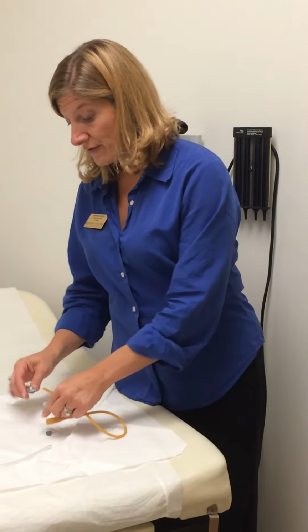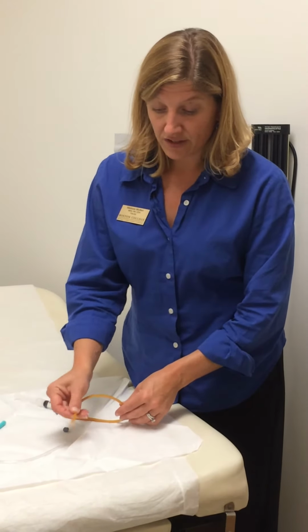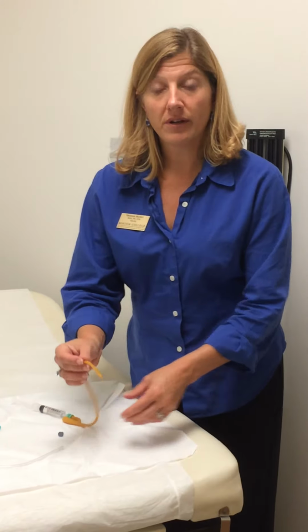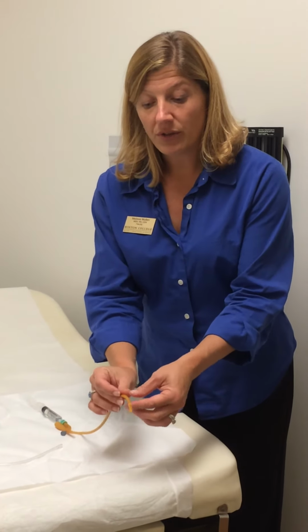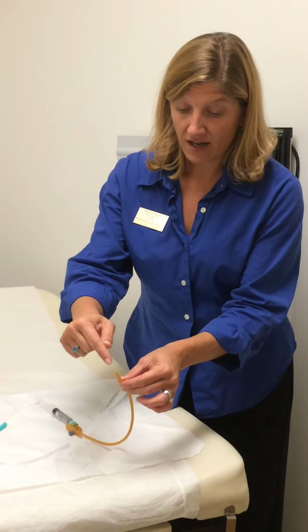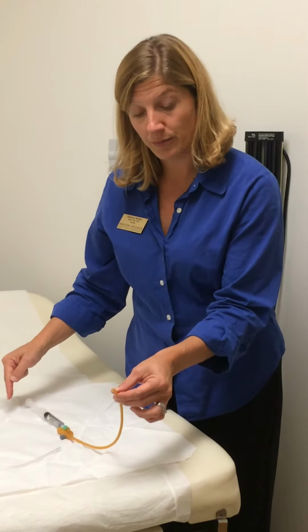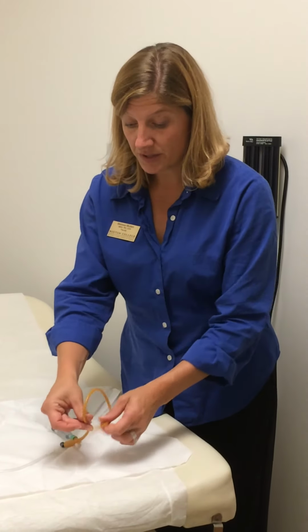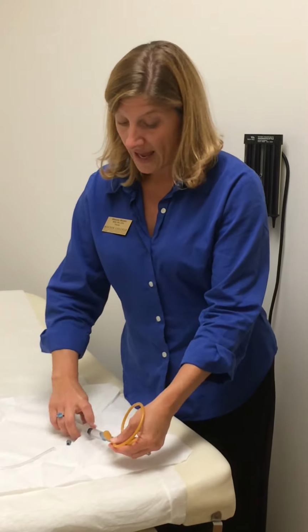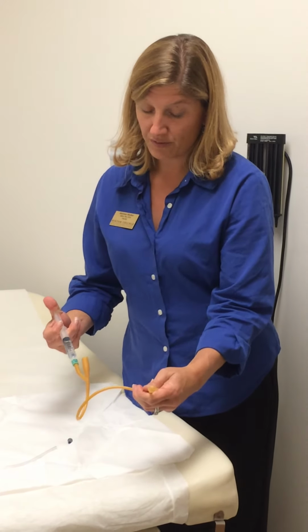So once again, after you have followed your sterile technique, you've lubricated the end of the tube so it'll gently slide into the urethra, you've put it into the urethra, up into the bladder, and the holes at the tip will give you a positive sign that you're in the bladder and you're in the right spot, and urine will start flowing out of the tube. You continue to insert all the way up to the Y so you know you're securely in the bladder, and then you gently inflate the balloon by pushing on the syringe.